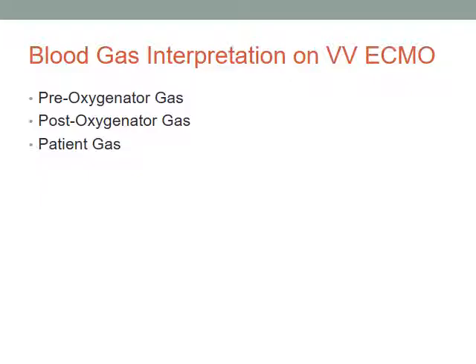Okay, because you have recirculation. Exactly the opposite of what you're used to. That's one of the things that makes ECMO kind of fun and confusing. And the other thing is increased circuit flow. The higher you turn up your flow rate, the more likely you're going to get some turbulence and some flow that doesn't go where you want, and some of it spills back.